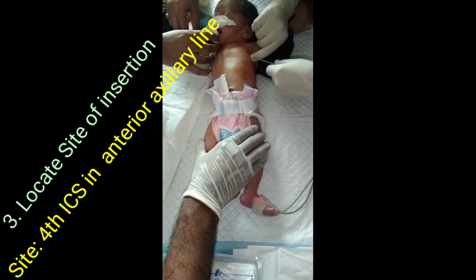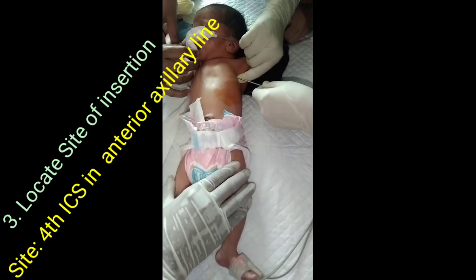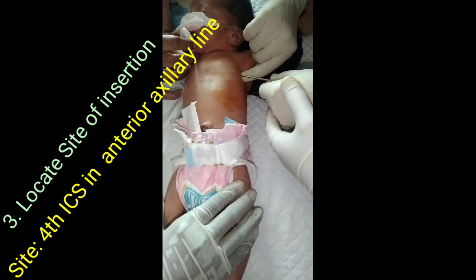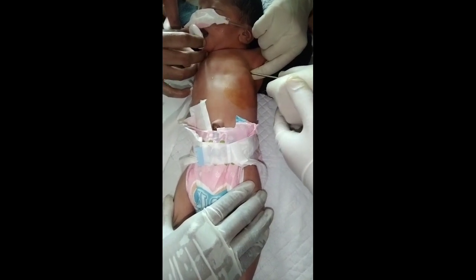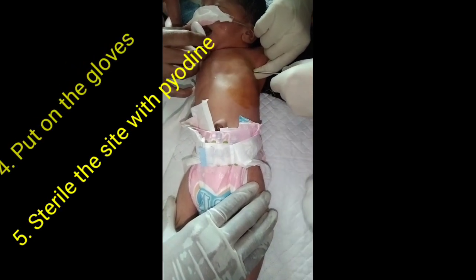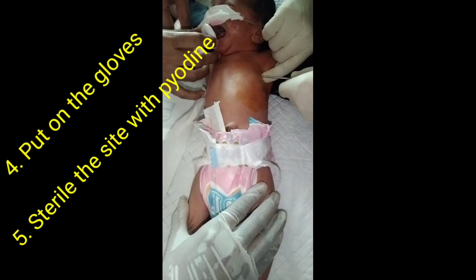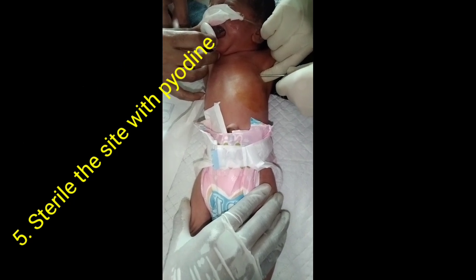Third: locate the site of insertion. The site is the fourth intercostal space in the anterior axillary line. Fourth: put on gloves. Fifth: sterilize the site with pyodine.